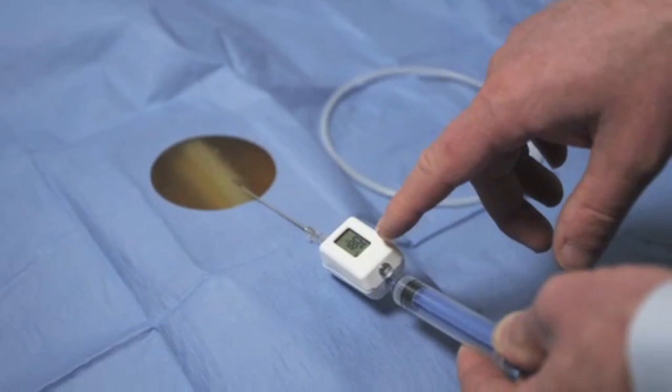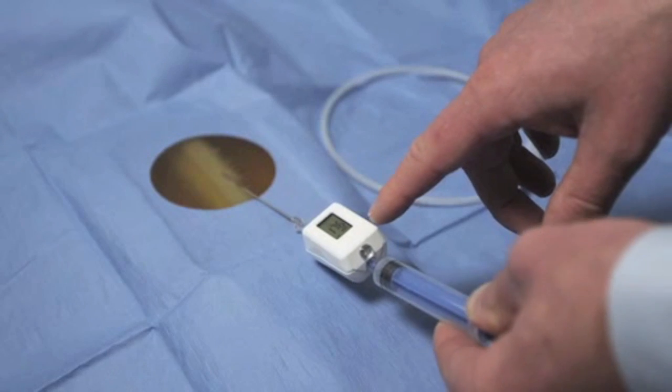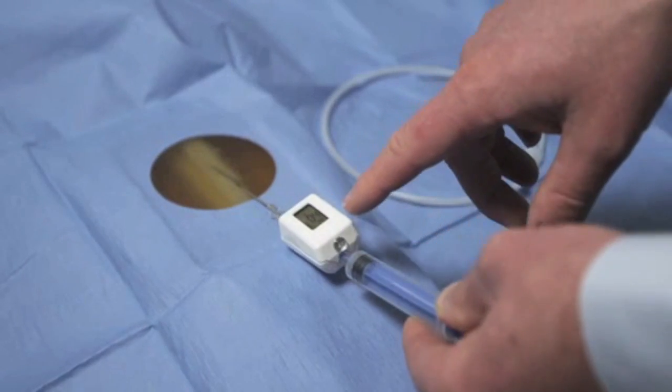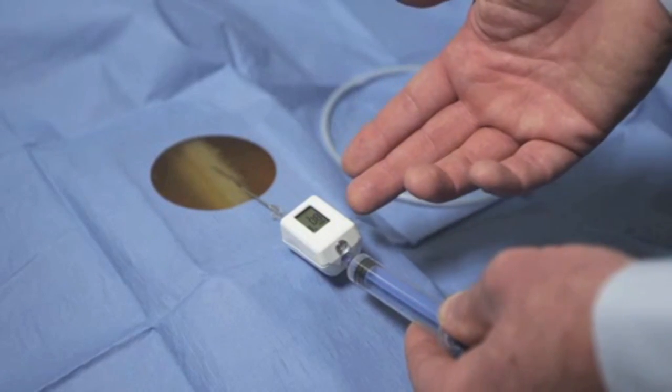The device will display a negative number during aspiration and advancement. Once the vessel is hit, the pressure should instantly rise to a positive number.